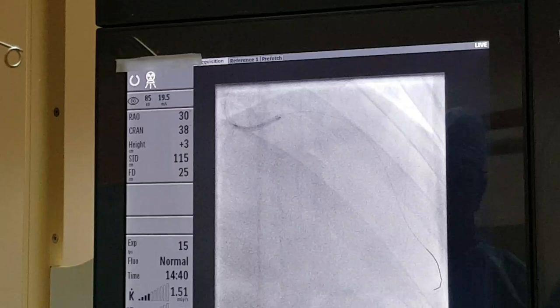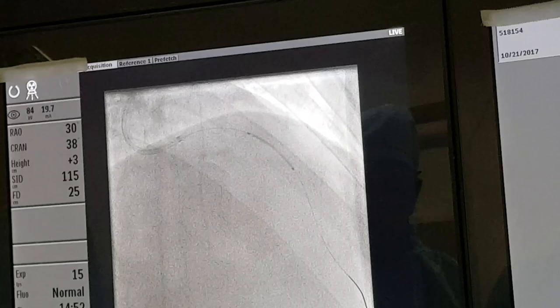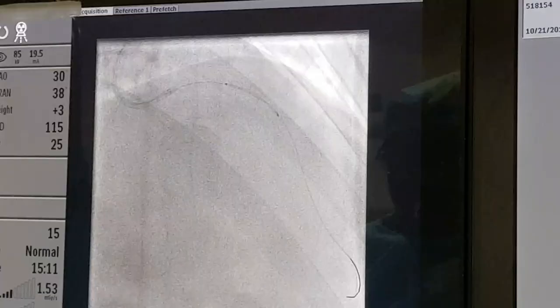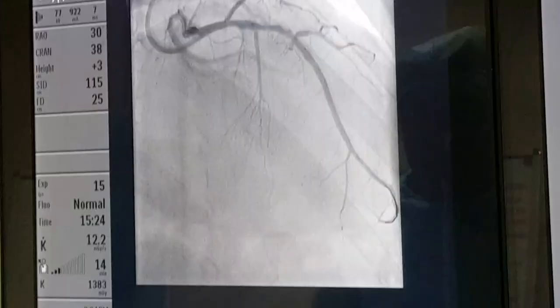The stent has entered the coronary artery. You can see two markers — the stent is being advanced and will be positioned across the site of the block. It has been positioned, and I am going to check whether the position is correct by injecting dye. The position of the stent looks fine — now sister will be deploying the stent.